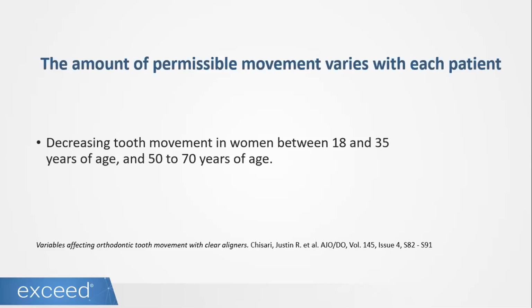So it is also important to take into consideration that in our population, we might need to make movements a little bit slower, or maybe use those aligners a little bit longer, or actually the opposite. This is also why we want to do simple cases at the beginning, because we want to get experience on how our patients react.